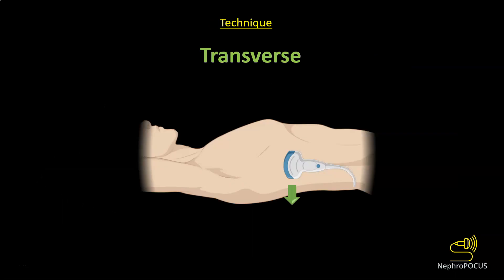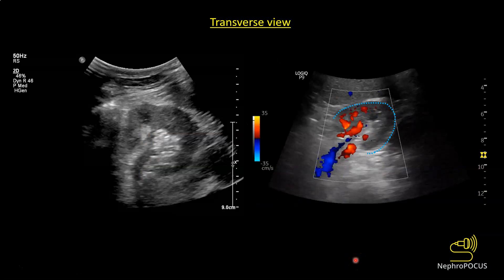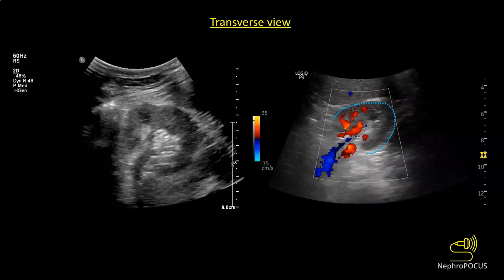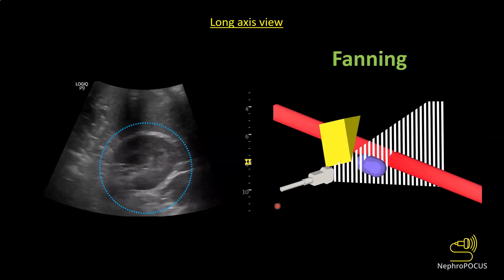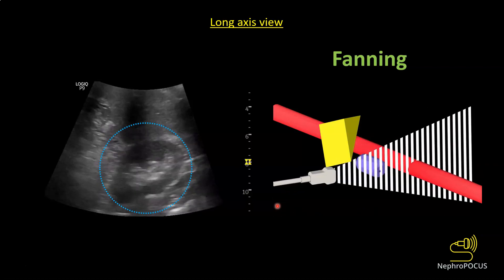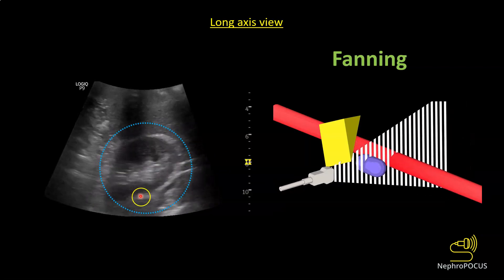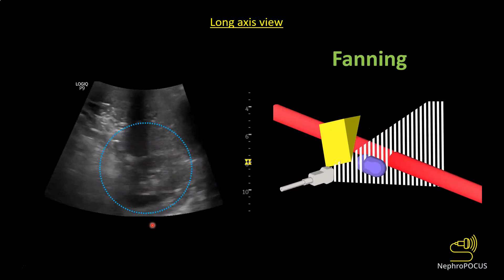After the long axis view, rotate the probe counterclockwise such that the probe orientation marker faces the patient's bed on the right side and faces anteriorly on the left side. Then you will get a short axis view of the kidney. Here is how the transverse view of the kidney looks in the middle or hilar part. In the hilum, structures are entering and leaving the kidney, so the kidney parenchyma appears C-shaped. Once you find the transverse view, fan the transducer superior-inferiorly to visualize the entire kidney. As you go towards the poles, the kidney becomes more rounded, and in the hilar region it is more C-shaped.